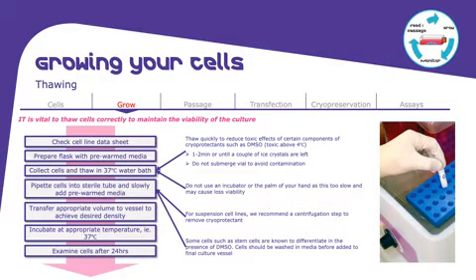So to remove the media. After that, you transfer into an appropriate volume vessel to achieve the desired density. It is also very important to count your cells, or to know how many cells you have in the vial, so you add an appropriate amount of media. Otherwise, they will eat up the growth factors and supplements too fast, and you will see the media change to yellow too fast. You need to incubate it at 37 degrees, and of course examine your cells, check that they feel comfortable after 24 hours.